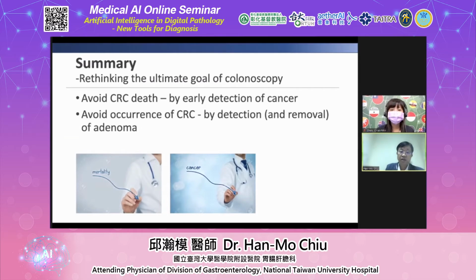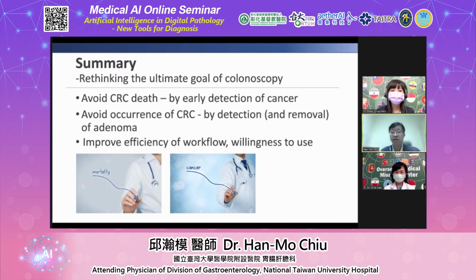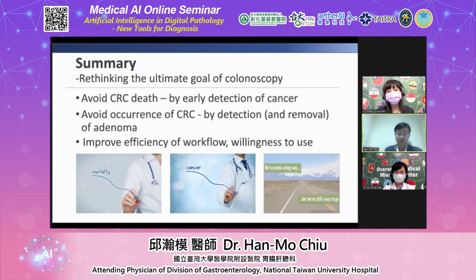In summary, ladies and gentlemen, it is about time to embrace AI-assisted colonoscopy in our practice. But if you rethink the ultimate goal of colonoscopy or colorectal cancer screening, there are still many aspects where AI could play an important role or even become the game changer, which need further exploration and elaboration. Our future challenges include how to implement it into the clinical workflow, how to enhance the willingness of doctors to use it in their practice, or how to evaluate its efficacy using hard outcomes such as colorectal cancer incidence and colorectal cancer mortality.